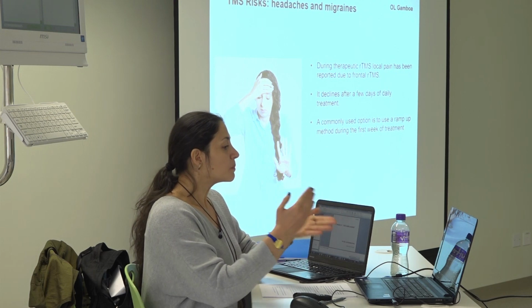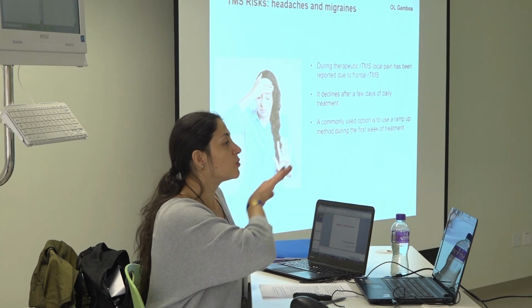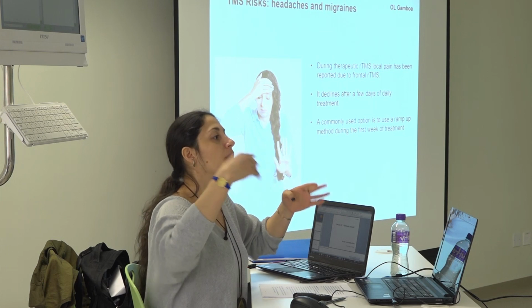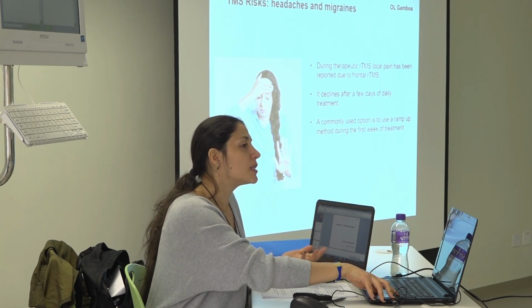But in the treatment, as it is painful in the beginning, they try to use a ramp up. They probably start with a certain dosage and then increase it until they reach the level they want, and then the pain is lower and better for the person. Anyways, if you have the pain, it is not permanent. It will decline. You will get used to it. I think it's more that.